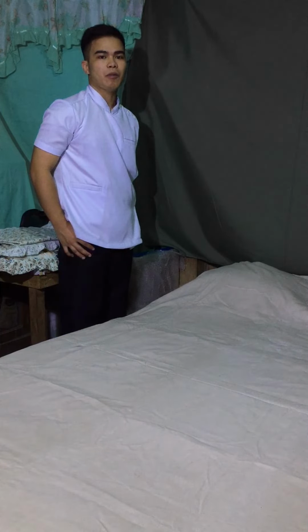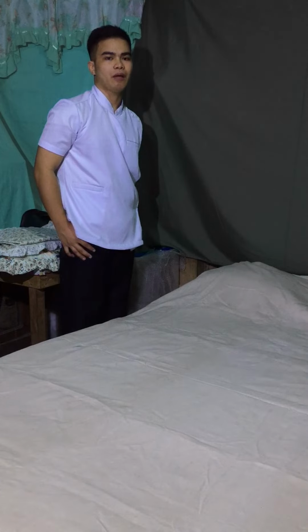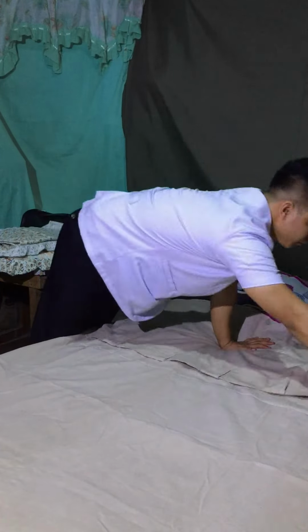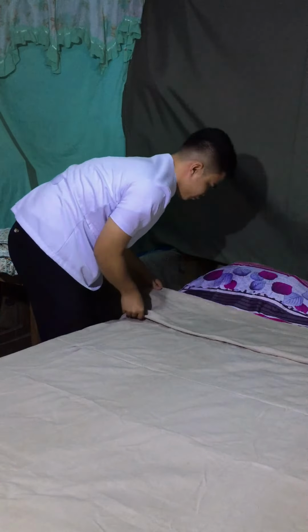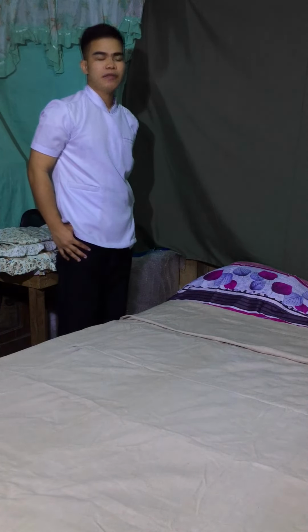Then, fold the top of the top sheet down over the spread, providing a cuff. The cuff of sheet makes it easier for the patient to pull the covers up. Then, move to the other side of the bed and secure the top bedding in the same manner. This is for an orderly procedure.